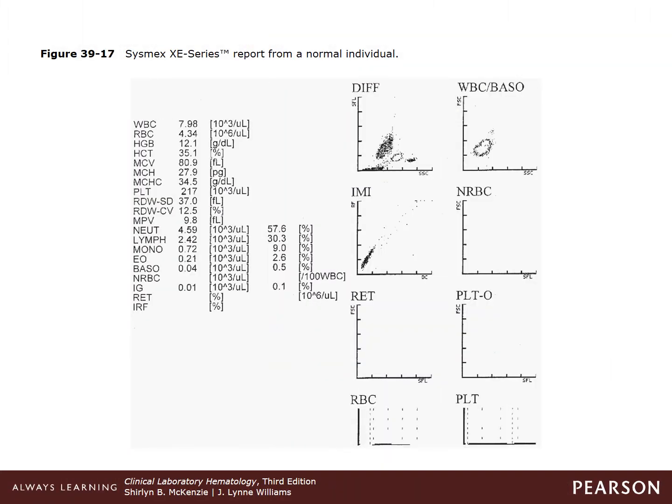Okay, now let's dissect another one of the major manufacturers of hematology instrumentation, Sysmex. Sysmex incorporates 4 different technologies, including impedance, radiofrequency, absorptive spectrophotometry, and flow cytometry with dyes to determine the CBC, 5-part diff, NRBCs, and reticulocyte count. An aliquot of the specimen is taken for the red cell and platelet counts, which are determined using impedance, similar to the Coulter instruments.